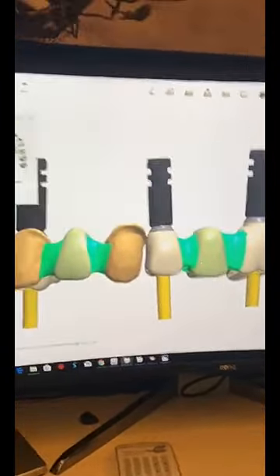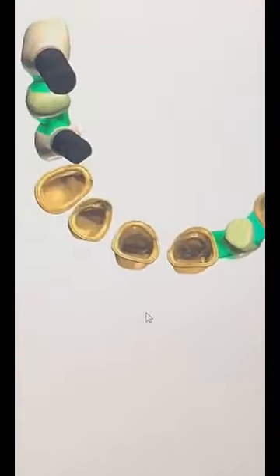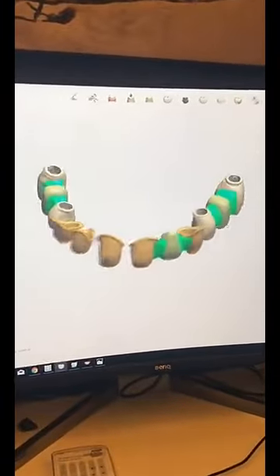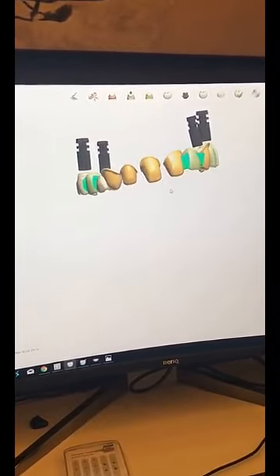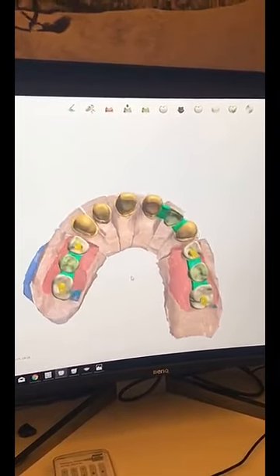Can you show us the prosthesis in separate formats? Okay, as you can see, the margins are clear. All these impressions are taken digitally. Okay, and you can see that this gives us an idea of the placement of the crowns specifically, accurately on the implants by means of screw retained implant supported prosthesis. So we've talked about different applications for digital dentistry in your dental practice.